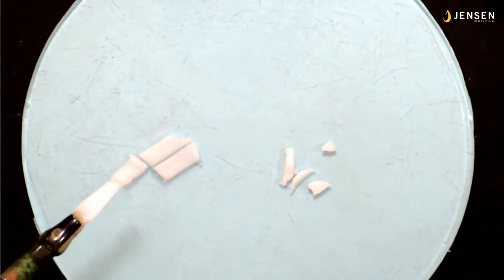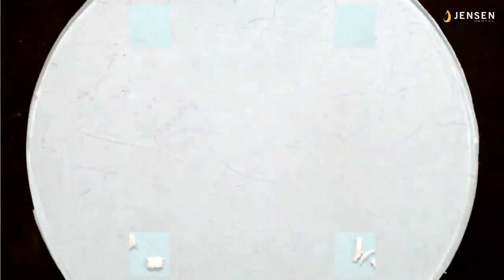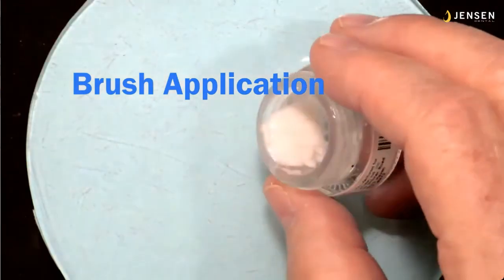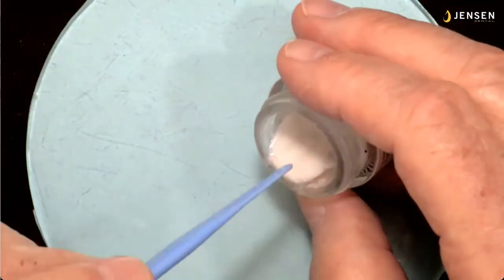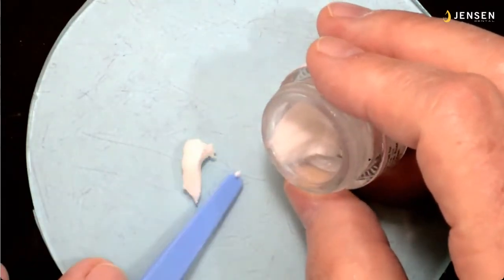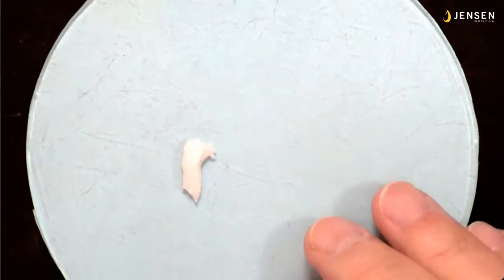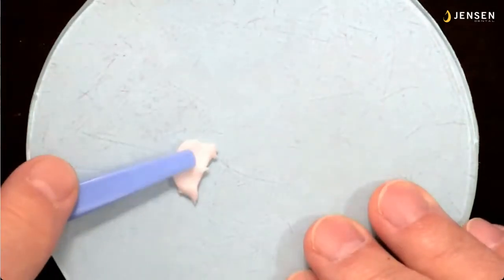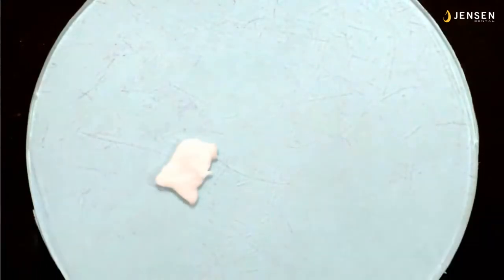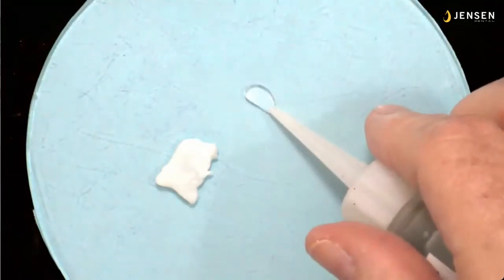And you can see, you can manipulate this material, but I'll put this on the facial of my restorations. And just like I was tiling a floor, I'll put one piece close to the next piece, close to the next piece. And then once I get them as close as I can, I'll push them down with a flat brush, kind of like those paste opaque brushes we used to have. And I'll use a little bit of water in the brush. And you can use water with the structure, not with the MiYO colors, because we're not trying to see the final color. In fact, the more opaque it is, the easier it is for us to see the surface texture. So there's some of my distilled water, nicely labeled.